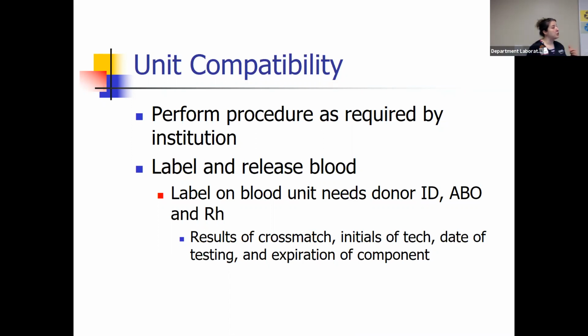And whatever testing you perform, your initials or your ID number is always attached to that testing. So if you did ABO, RH, and an IAT and set up 2 units on a patient yesterday, I can log in the system and see where Fiona set up these 2 units yesterday, all right? The computer will tell you. So it's always attached. We can always see who did what.